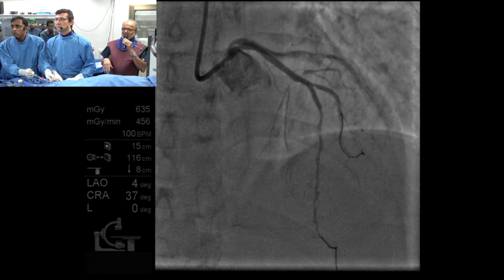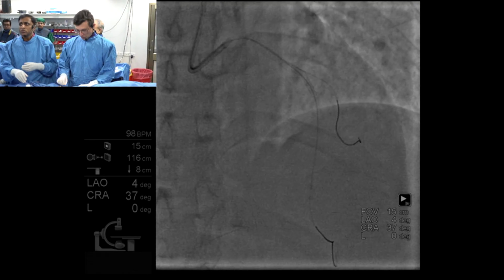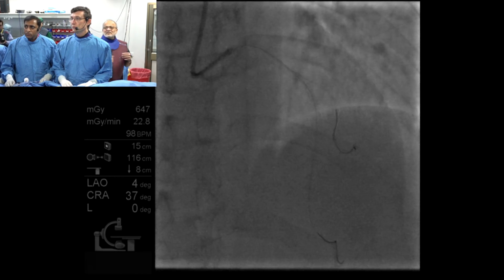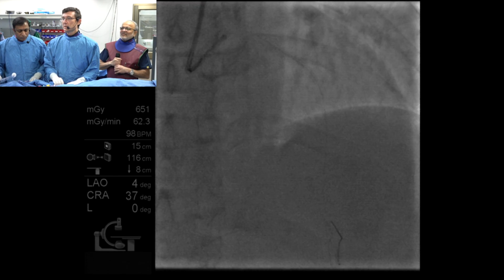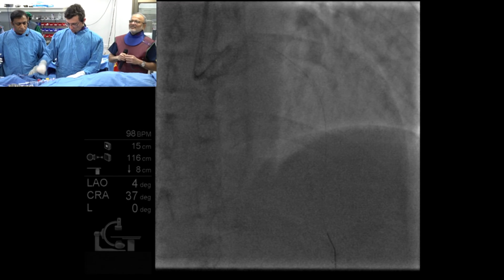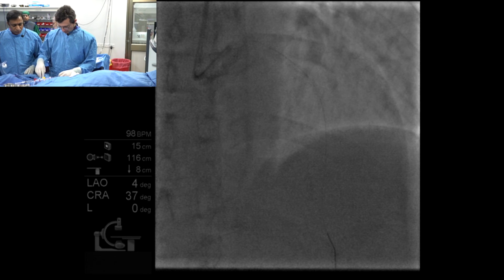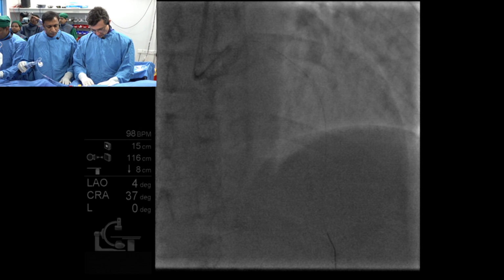After doing 15-20 cases, if you confront a complex case, it is good to visualize on a big screen. So what I'm going to do next, I'm going to pull the side branch wire, and now we are going to proceed to repeat the OCT and hopefully get good feedback from Akasaka Sensei.